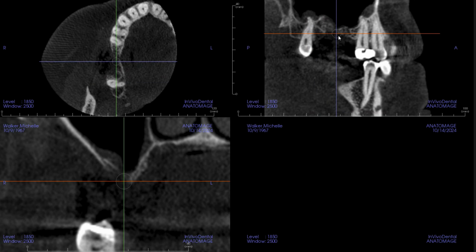When they're small, they're sometimes hard to see, but when they're there, they're there. But you're still in that middle ground period where it's possible that there's a pinhole communication so that you can't really see it. With that said, the location of the inflammation would give you a lot more information.